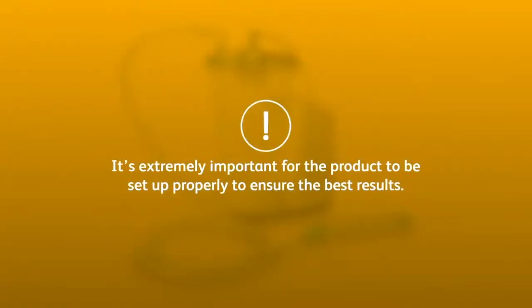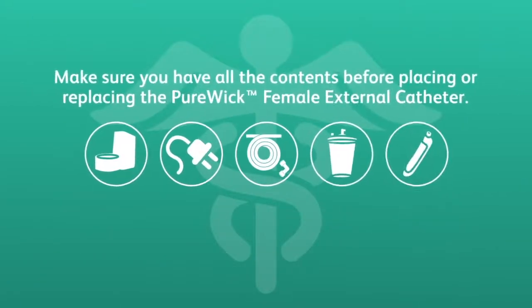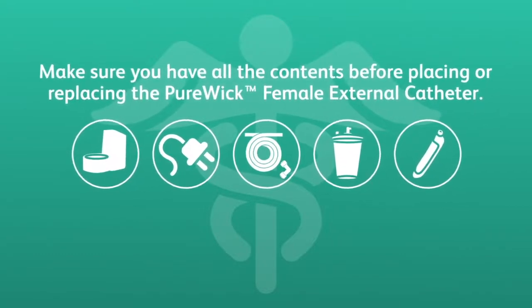It's extremely important for the product to be set up properly to ensure the best results. First, make sure you have all the contents before placing or replacing the Purewick Female External Catheter.